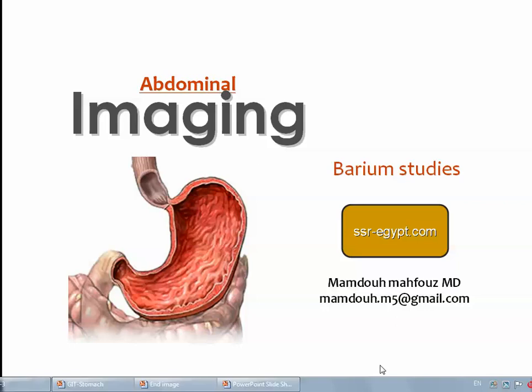Dear colleagues, we are continuing the gastrointestinal imaging series, and we have finished the sector of the esophageal imaging. Now we are continuing the series by discussing imaging of the stomach.